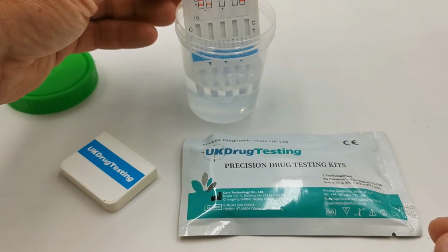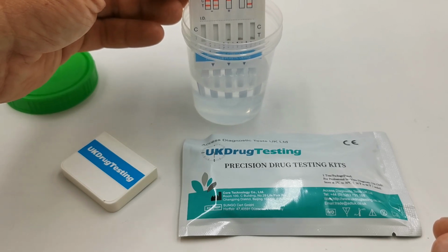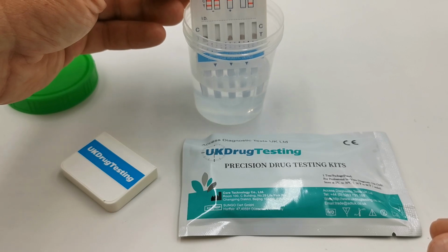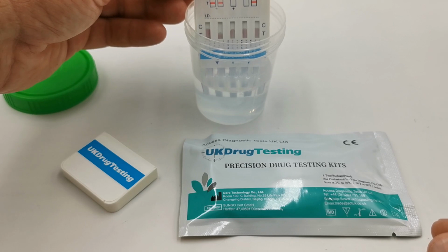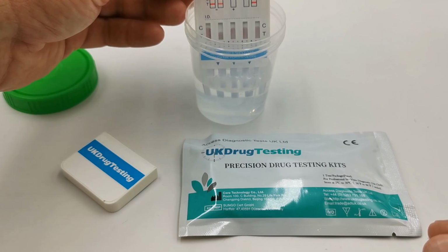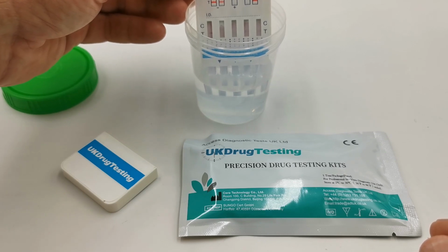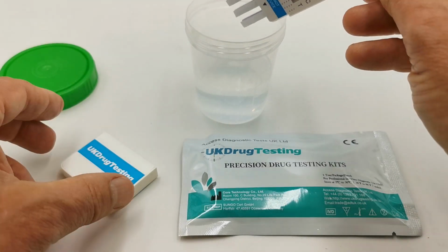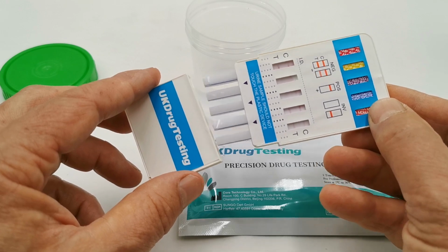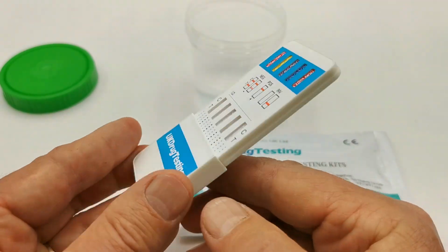The sample should not touch the bottom of the test panel device, and it needs to be placed into the sample and held steady for around 5 to 10 seconds. What you can see already occurring in this panel is that pink dye laterally flowing up through the test result window area, and you can leave it in there until you're confident that sufficient sample's been absorbed. When it has, you can remove it from the sample and place it back into its cover. And you'll see both sides are starting to run.